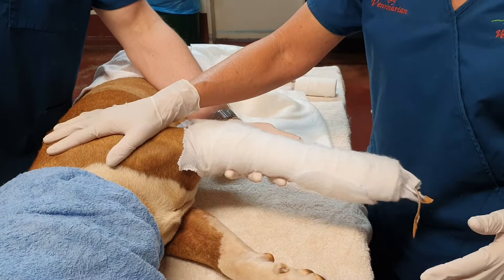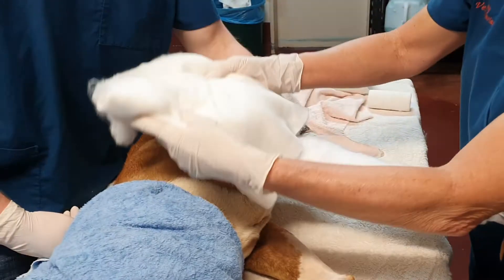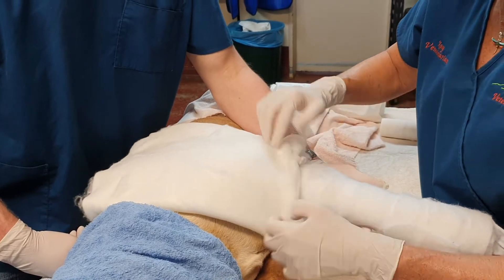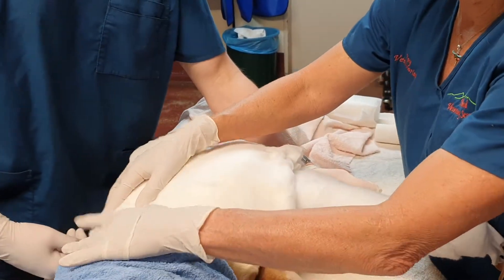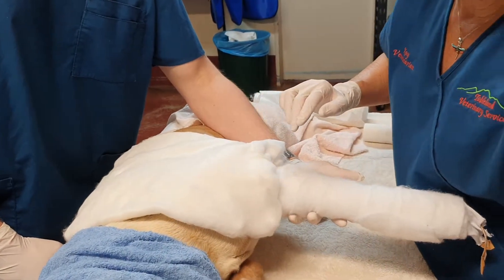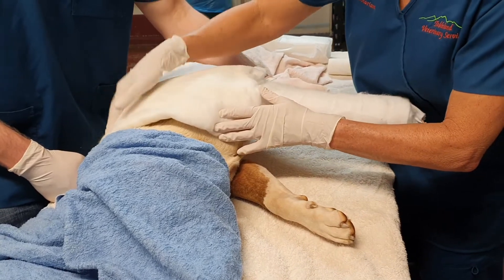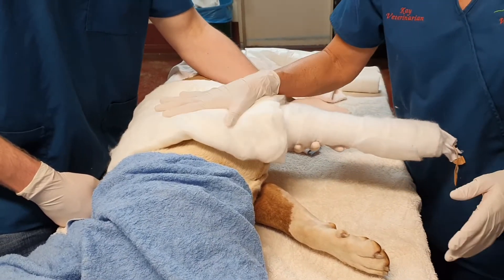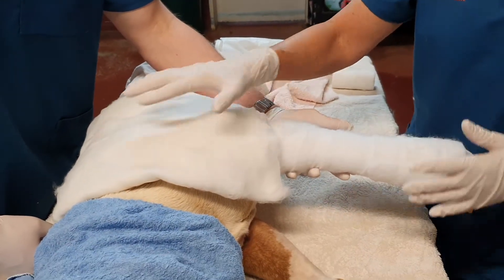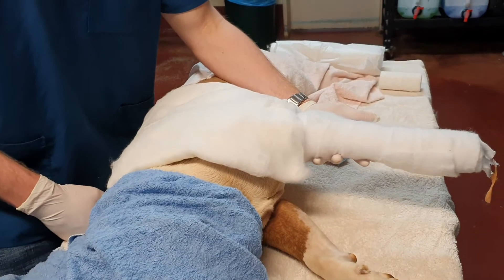This is a medium-sized dog, so I'm going to use several thicknesses of cotton wool for the padding at the top. I've used soft band on the most distal segment and thick layers of cotton wool on the most proximal part. I want that to come over the front of the shoulder. The bottom leg is either forward or all the way backwards — I prefer it to be all the way forward. The padding should go past the midline at the top. Now we come to our next layer, which is the conforming material.